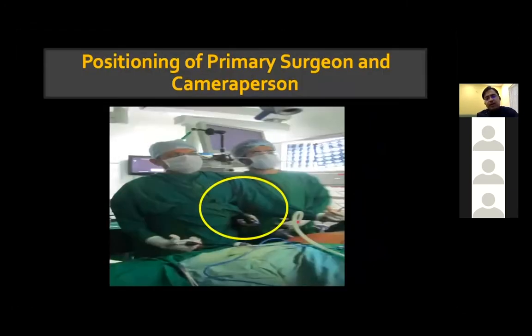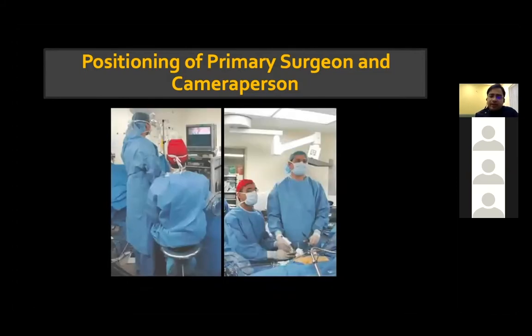Now, how does a camera driver stand in relation to the operating surgeon? The camera driver should give enough freedom of movement to the operating surgeon. If the camera driver is tall, he can sit down as compared to the operating surgeon.